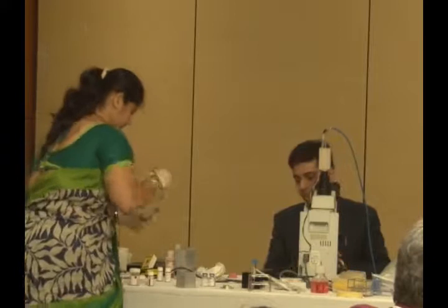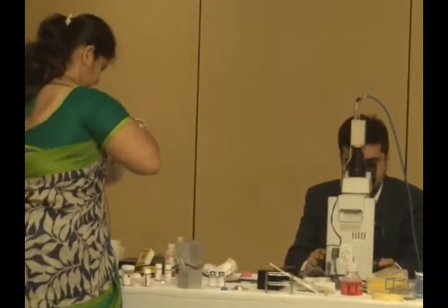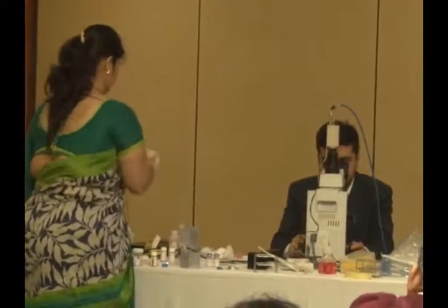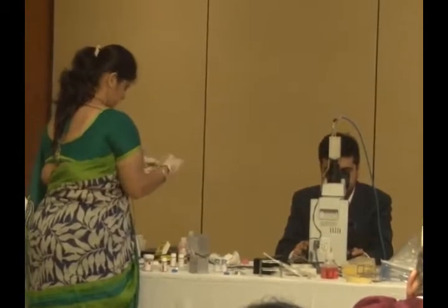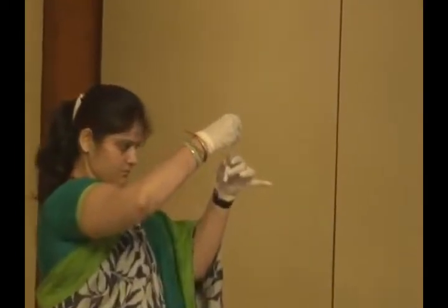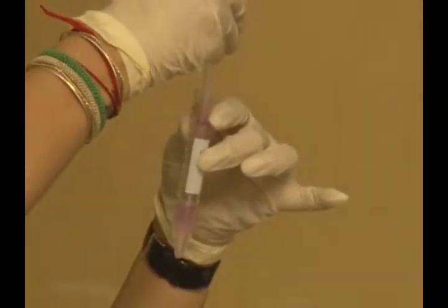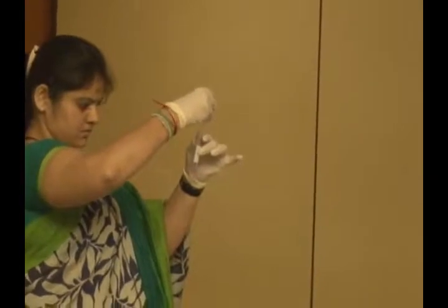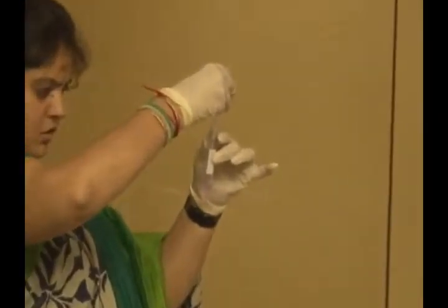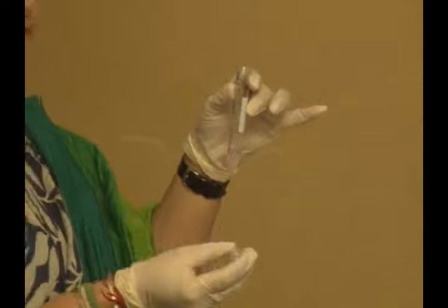So now remove the supernatant. Be careful, otherwise you will disturb the pellet. Go in a circular manner, so you will take all the debris which is lying at the surface of the tube.